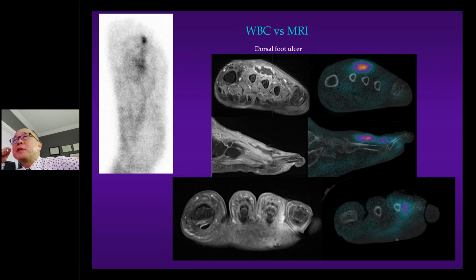Now, again, it can be done, and I do insist, when properly executed with contrast and properly imaged with proper imaging criteria, I think it's equally accurate. It just needs to be done correctly. And so I think they are equivalent. And of course, there occasionally comes a question of, well, then what is the indication? Clearly, this MRI study was ordered by the surgeon because he wanted to know the abscess distribution.